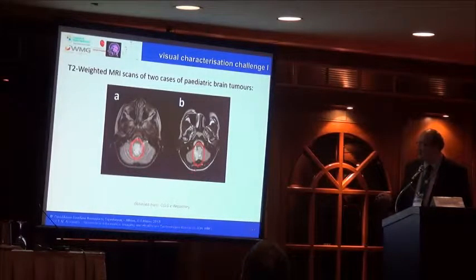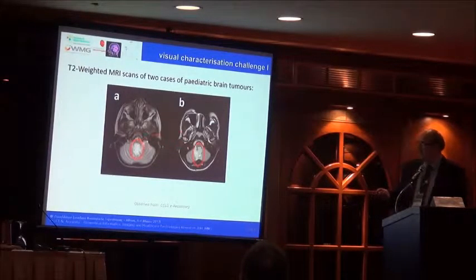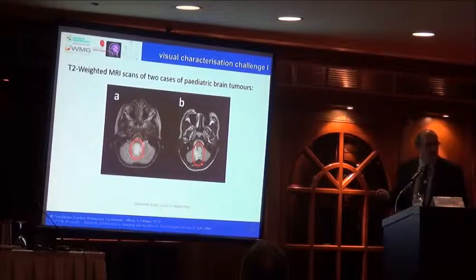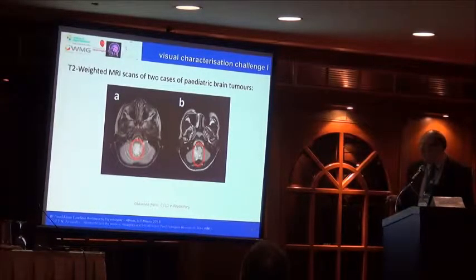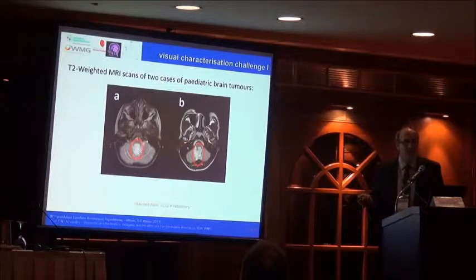So these are two tumors, again in the posterior fossa. We have three major types of brain tumors in this area. Unless you know some clinical information, it is very difficult to discriminate between the two types. So if you look at these images, the tumor structure looks almost similar, slightly offset, because it's two different patients, and it's very difficult to decide if this is an ependymoma or an astrocytic tumor.